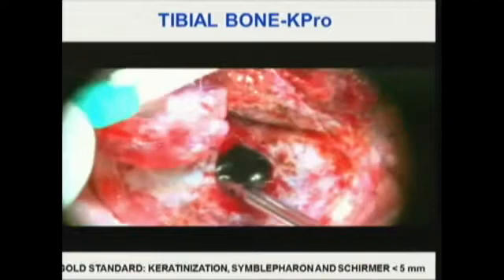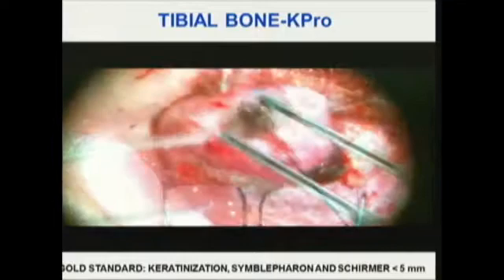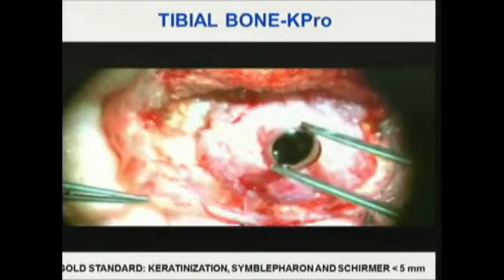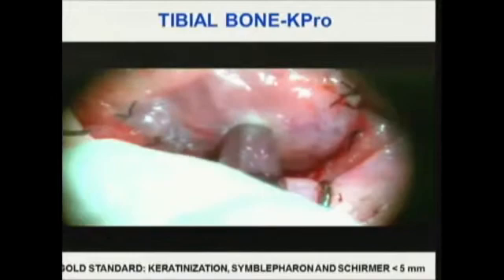We did anterior vitrectomy and also the anterior chamber is filled with the cohesive OVD. We introduced the 4.5 or 5 millimeter posterior part of the keratoprosthesis in the hole, and we secure the keratoprosthesis in 360 degrees, and we must take care that the keratoprosthesis won't be tilted. The oral mucosa is closed again, and finally a little window of 3 millimeters was done.